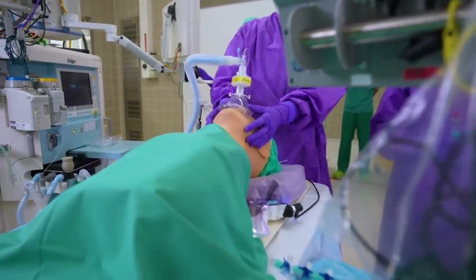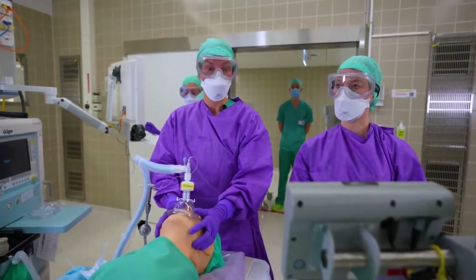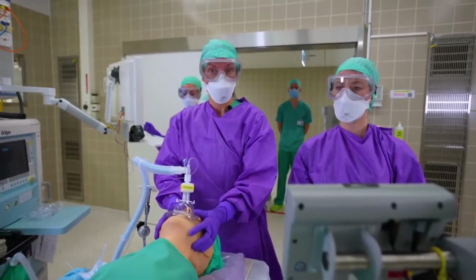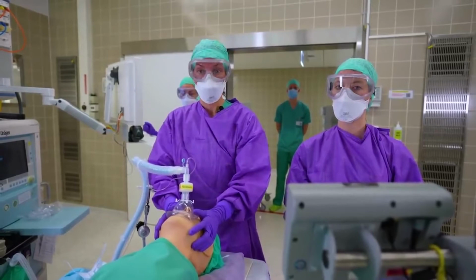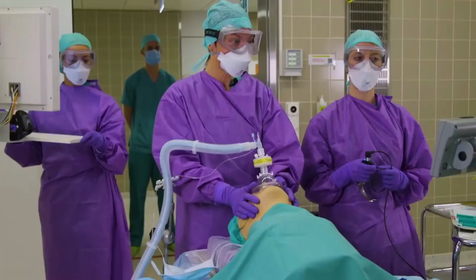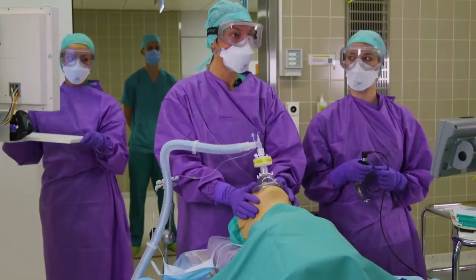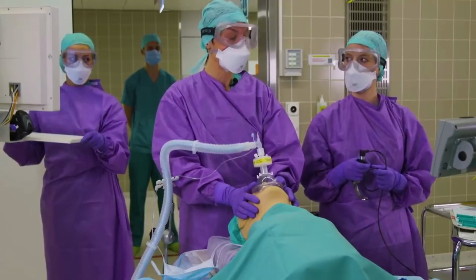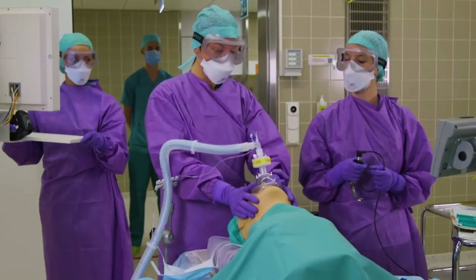After a thorough pre-oxygenation, we are starting our rapid sequence induction. RSI is used to avoid bagmasking the patient for prevention of aerosolization. Here, avoiding coughing with a thorough relaxation is also of utmost importance. We induce the patient and our patient is paralyzed.